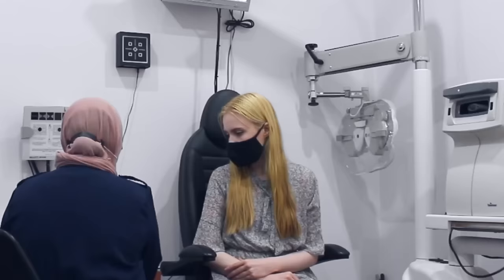Your pressures, the eye pressure that I took, absolutely within normal limits, okay? So I can see that your ocular health is very good. The external eye that I looked at with the other instrument, nice and clear, all right? That's so good. No problems there.